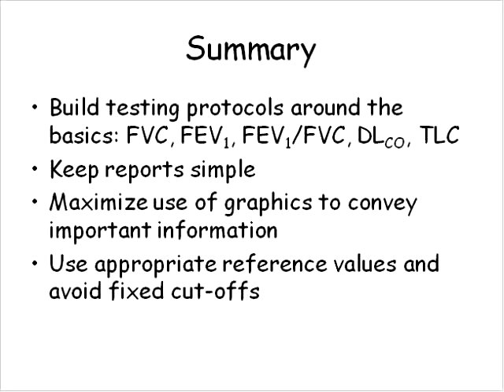In other words, the patient is breathing on the mouthpiece, and we can watch them take a big breath in, and we can see whether or not they take a subsequent big breath in when we have them do the forced inspiratory maneuver. But if you're using a bedside spirometer, or a spirometer that only allows you to measure exhaled volumes, where the patient has to take a big breath in and then quickly place the flow sensor between their teeth and lips, you may miss whether or not they got a big breath in, or whether or not any gas leaked out before they began.